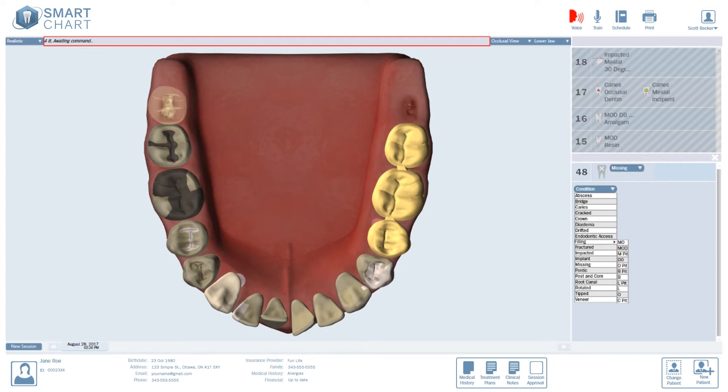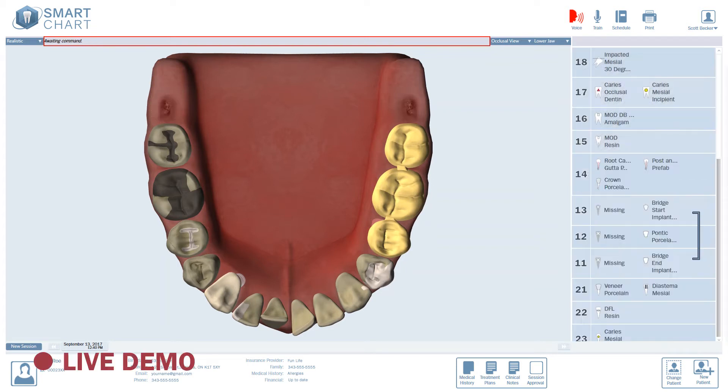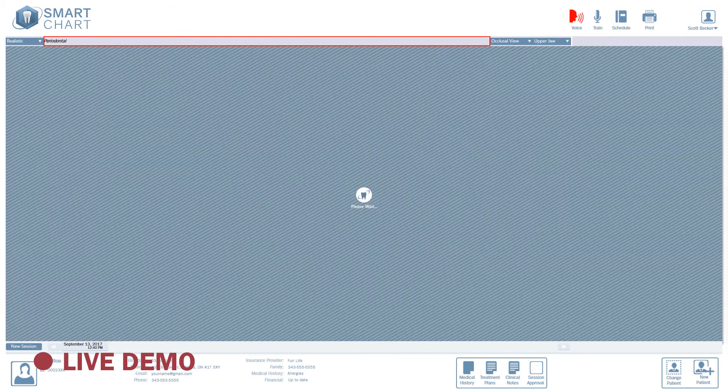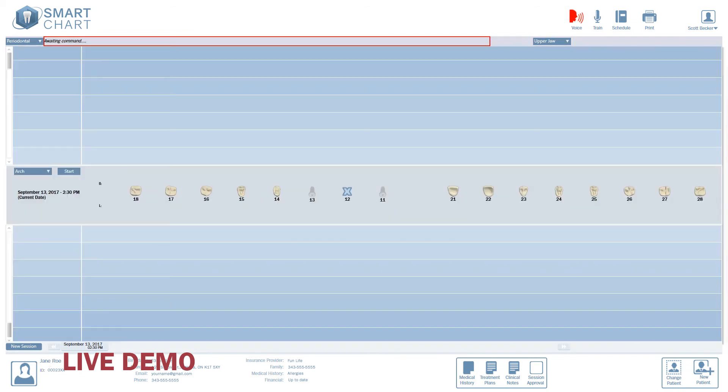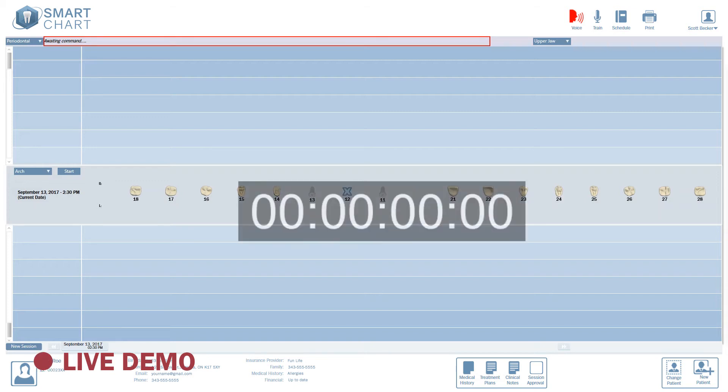SmartChart also does voice activated periodontal charting. Note the seamless transition. Close. Upper jaw. Periodontal view. It's already in the default arch mode. Now, as an example, let's just do the buccal side of the upper arch. SmartChart can record faster than anyone can actually conduct a clinical examination. Just like before, I'll continue to go faster than actual exam speed.